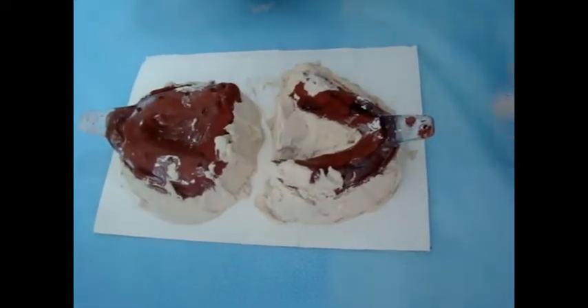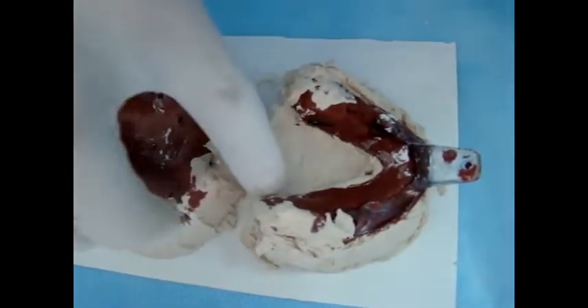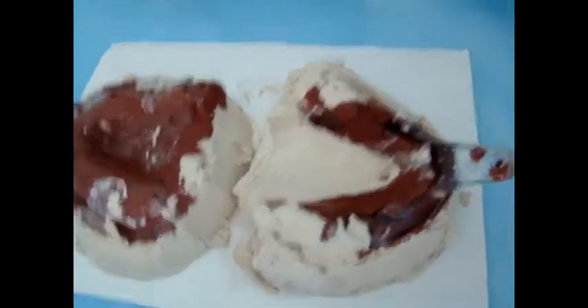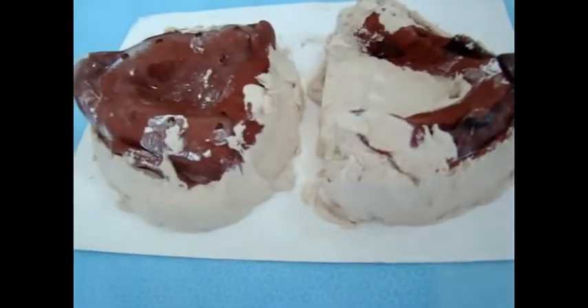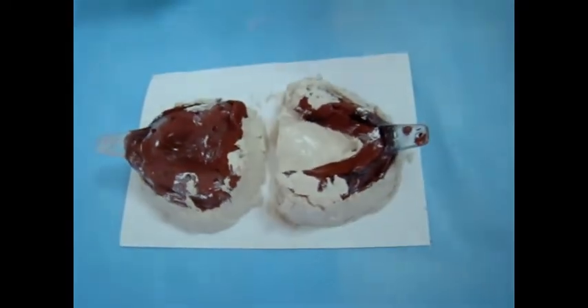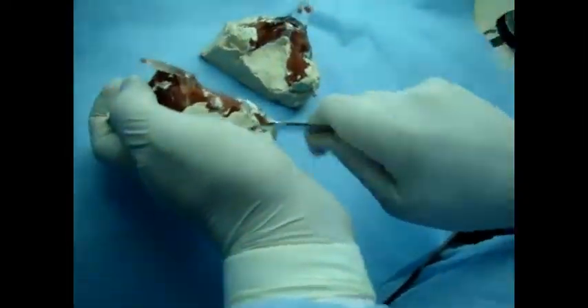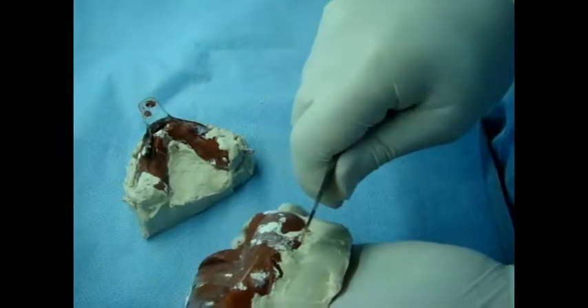Make sure that all anatomical areas of the impression are covered with plaster of Paris. Leave the tongue space clean. Any excess is better removed now because the material is still soft.